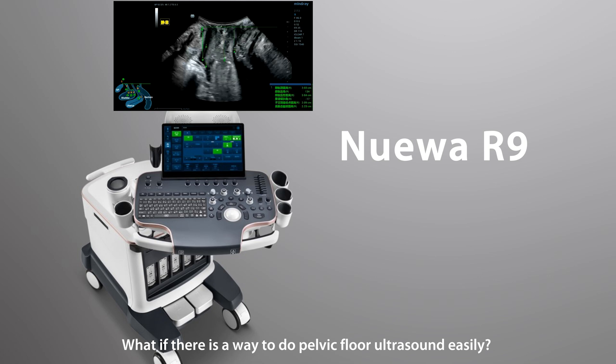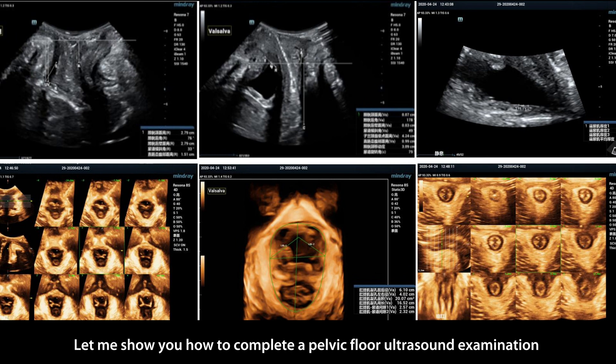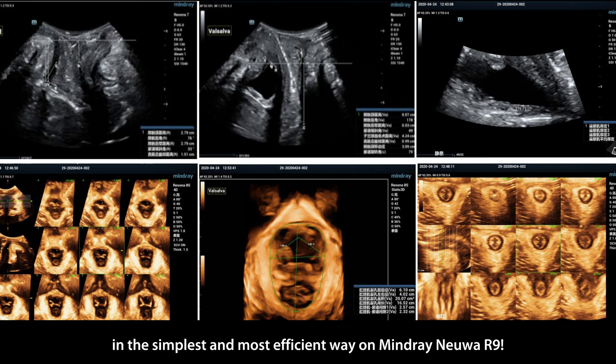What if there is a way to do pelvic floor ultrasound easily? Let me show you how to complete a pelvic floor ultrasound examination in the simplest and most efficient way on Mindray Nuewa R9.